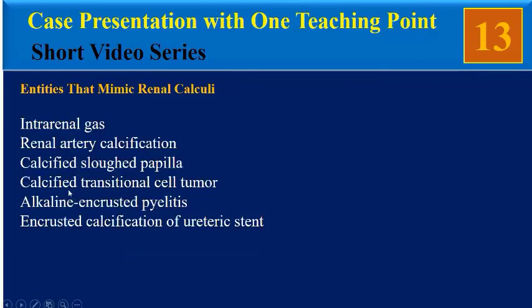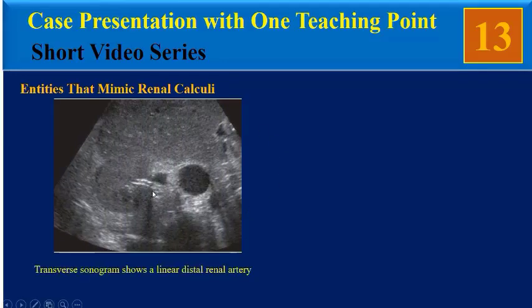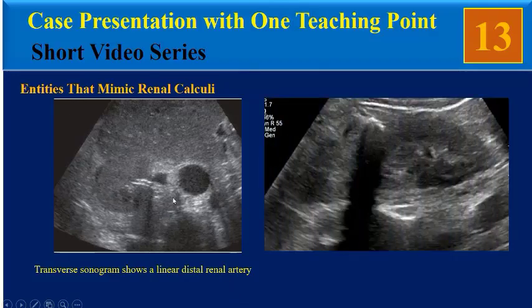Another differential diagnosis is renal artery calcification. As you can see in this sonogram, we can see parallel linear calcification related to a linear branch of the renal artery. Renal artery calcifications are usually located in the renal hilum, not in the periphery. Our patient is not compatible with this entity.